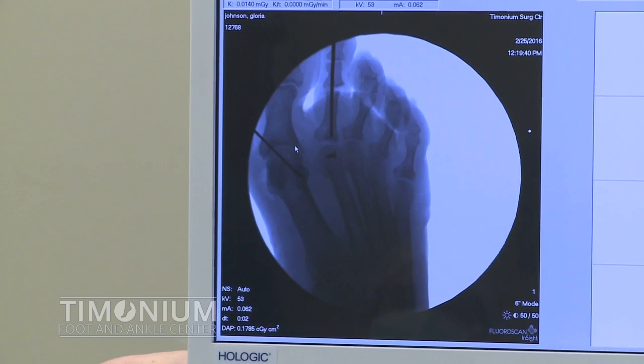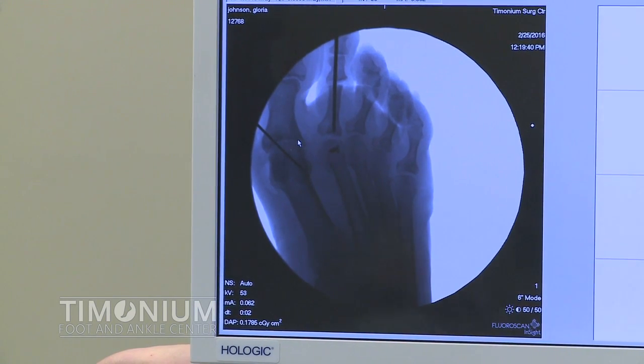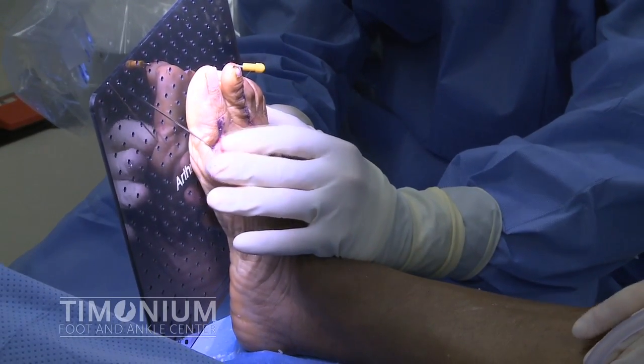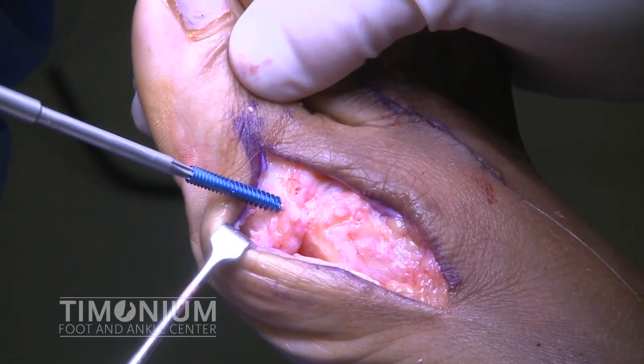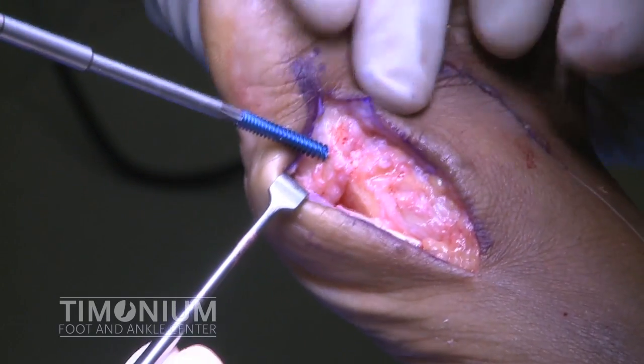A wire is then used to temporarily fixate the fusion. The placement of the wire is then checked on the mini C-arm. Prior to introducing permanent fixation, the position of the fusion is checked by using the top of the tray from the screw set. Next, a cannulated headless screw is placed across the first metatarsophalangeal joint.